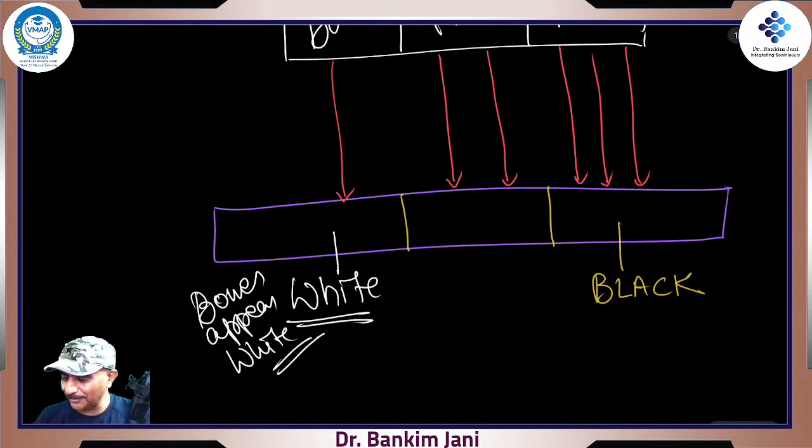Sometimes, in some civil hospitals, there are a few patients' relatives who are super smart. Invariably they take the X-ray lying over there and say, this black part here has gone bad, white is all good. It is not like that. The bones appear white, and air, wherever it is present, is black.